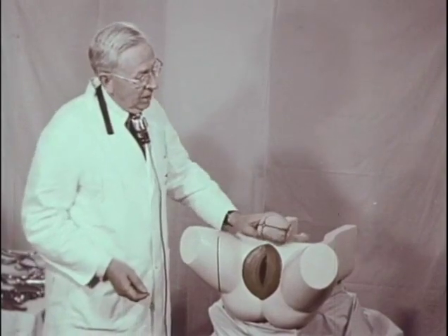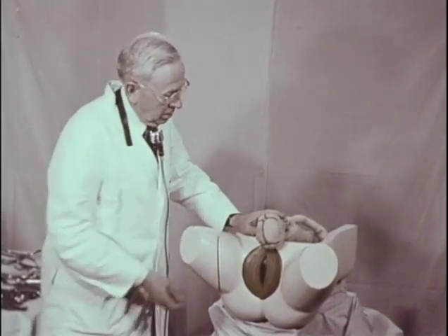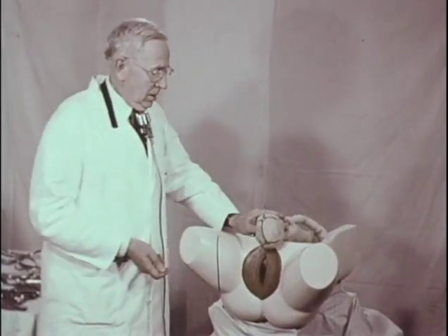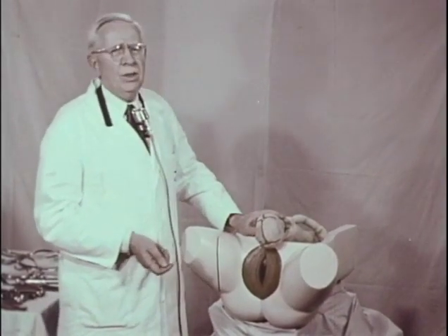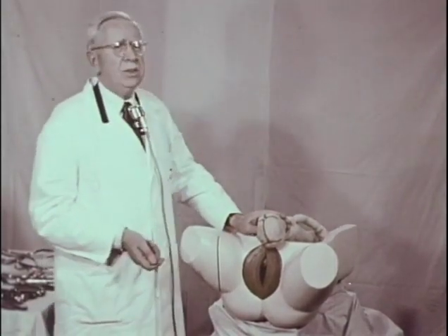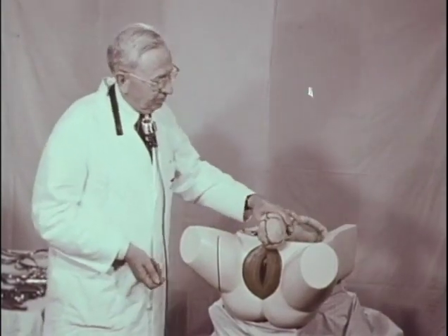Then we have the complete instrumental rotation of the occiput posterior to anterior, in which the Scanzoni maneuver and the key and lock maneuver are used. And finally, the special forceps, which will be considered later.